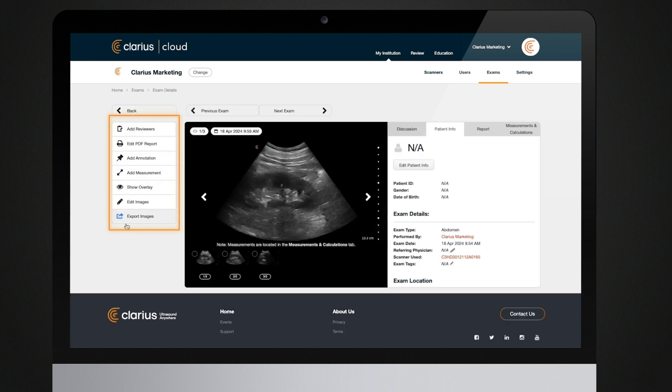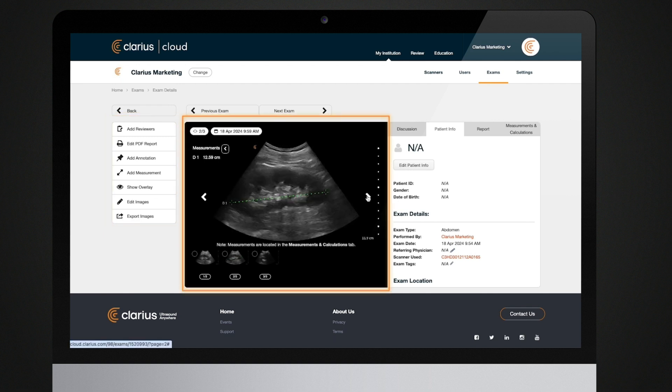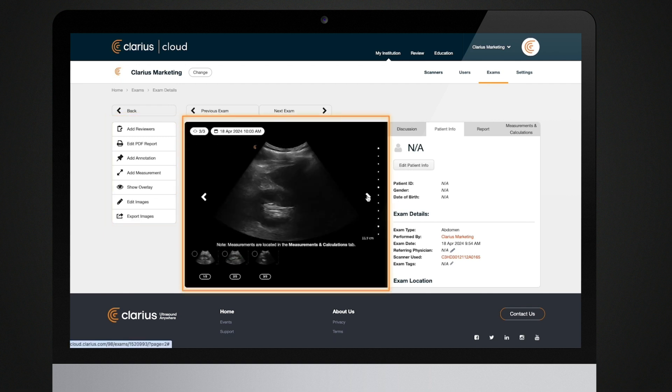On the left, you can see a menu with tools and features for this exam. In the center panel, you can browse through all of the images in your exam.